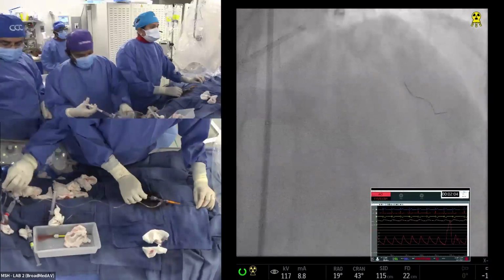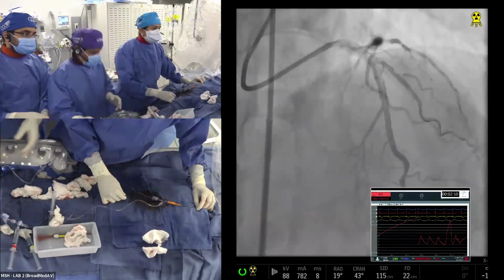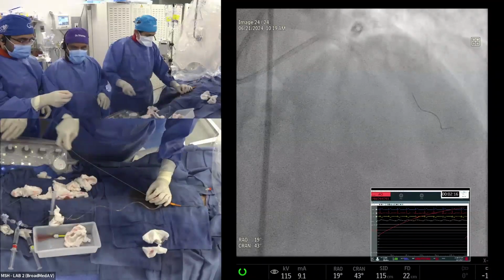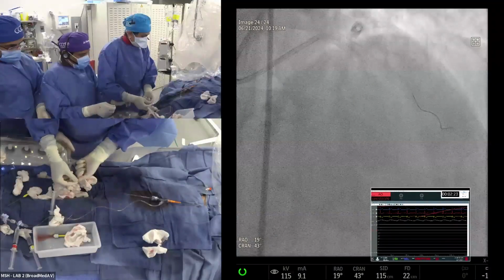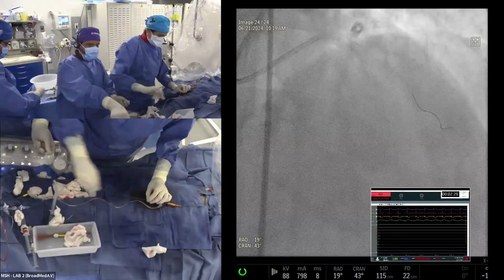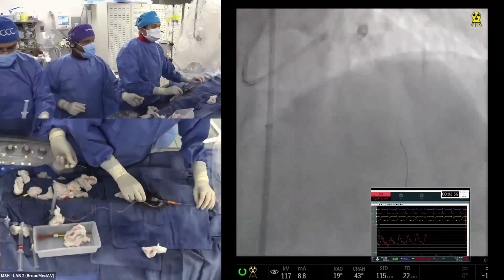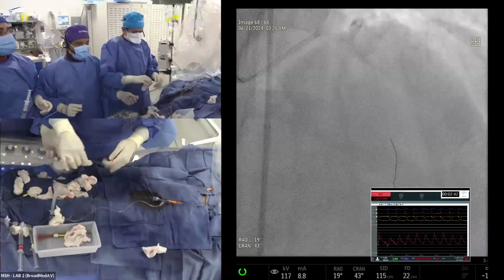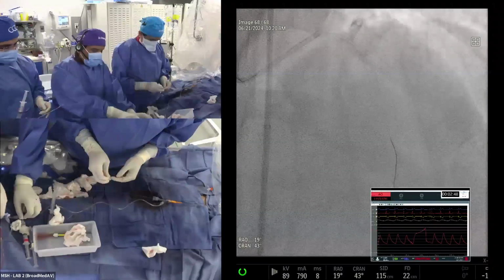Good. Sharma, we can do the IVUS of the LAD now, right? Yeah, what's the rationale behind going for a higher pressure deployment? Means 16. So many times you don't have to do the post-dilatation. We go with the 16, so we are not dilating again, and we have seen that 16 is okay. You don't go beyond that. Beyond that you get more perforations, I mean dissection. But 16 has been fine so many times when you have already done so much work at baseline. You don't need to post-dilate, although you can if need be. A lot of people will do 10 to 12 atmospheres and post-dilate within it. That's another approach, but ours is 16.